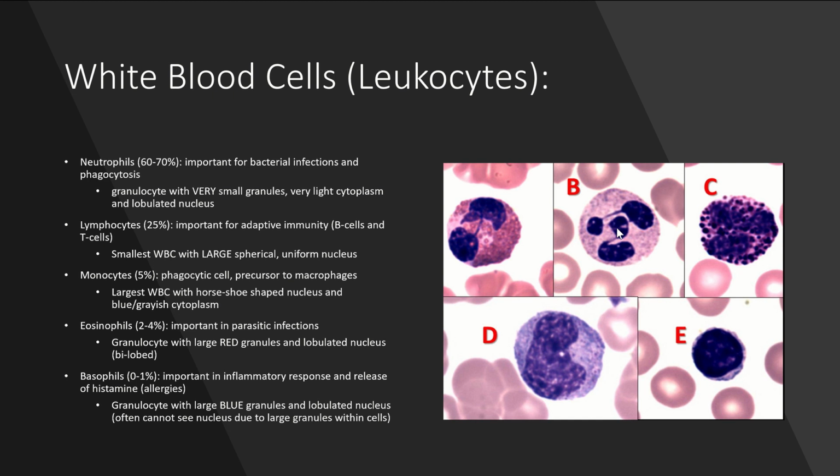Okay, so your neutrophils are really good at that when it comes to bacteria. That's what they specialize in, but they're also just good at eating some other random junk as well. And like I said, they are a type of granulocyte. We'll learn that you have 3 main types of granulocytes within your white blood cells. But the thing about neutrophils is their granules are very small. So you can barely make out some kind of graininess in here, right? But it's not very obvious. And you'll see in some of our other examples, you can barely see that graininess at all.